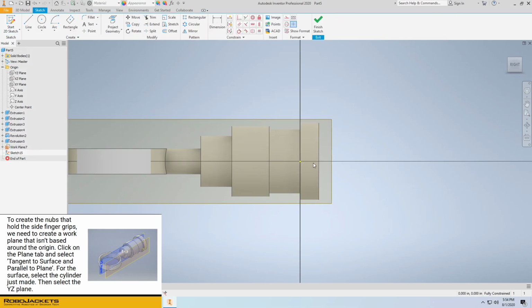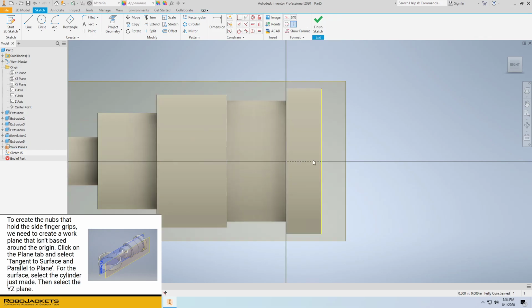Now we know we want this nub to be the same width as the height of the cylinder, and it's a square, so the height of the square should be equal to its width. To do this, we'll create a construction line from the origin out to this line. This allows us to choose our rectangle tool and center it at the center of this construction line. Bring it out to the wall here and give it some height.